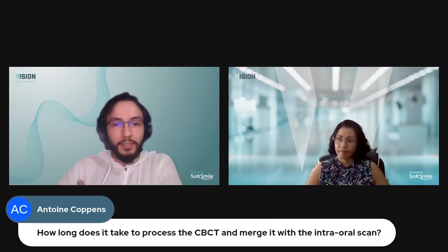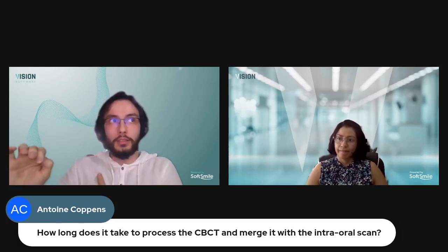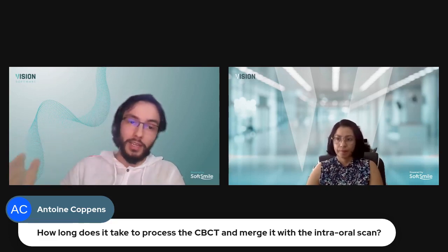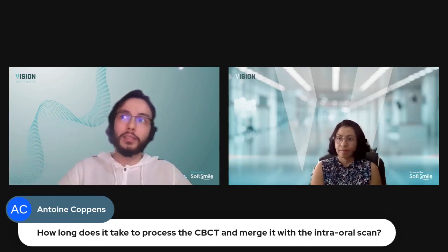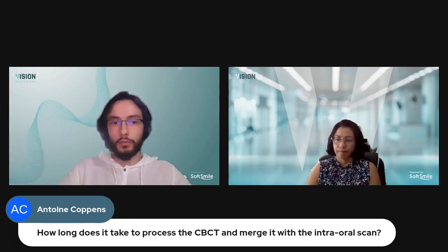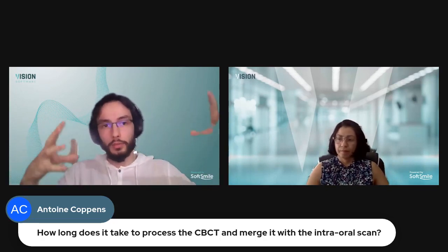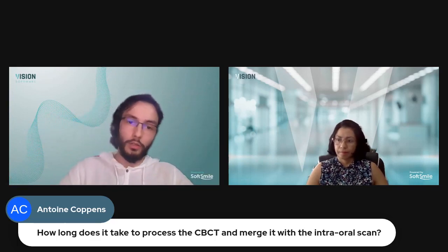So how long does it take to process CBCT? First thing, I would like to reiterate, it doesn't involve any manual effort on your part or ours, in fact. So no manual human labor is involved. It's fully automatic, and it typically takes 2-3 minutes to do it in the cloud. So it's going to sit there for a couple minutes to do the entire processing, and then do the merging. So do the segmentation, and as I described, merge them with the crowns, and then you can download it. So it's not long at all.